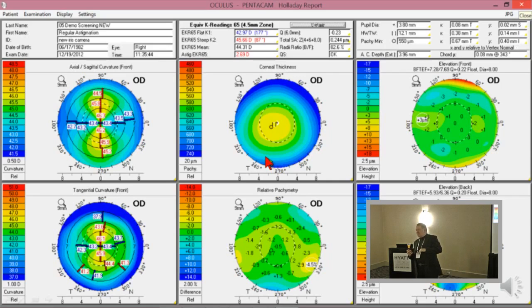So when you put in that 44, it sort of makes an error on the low side, compensating for the error that we overestimate the cornea. So it comes out a little bit more myopic than it should, is what happens. The EKR 65 has already done all that.